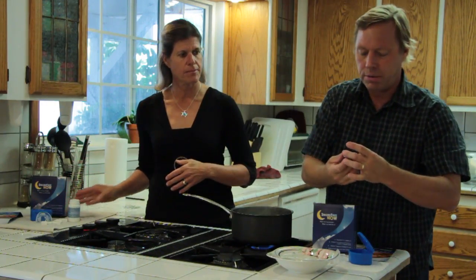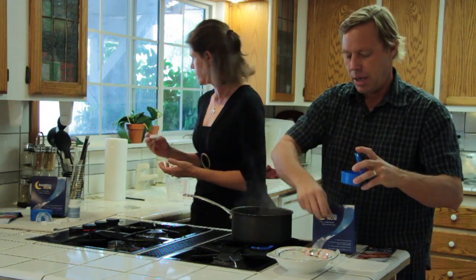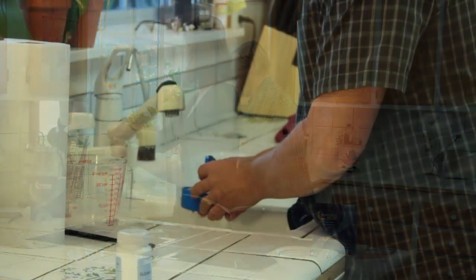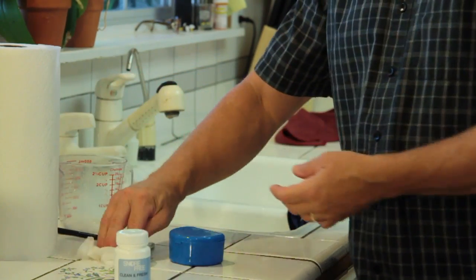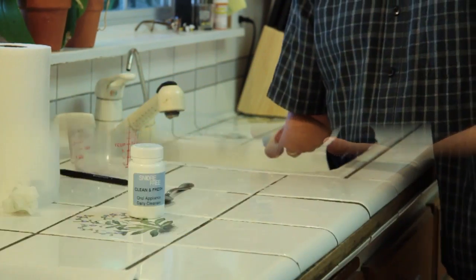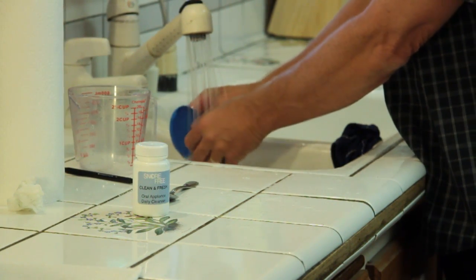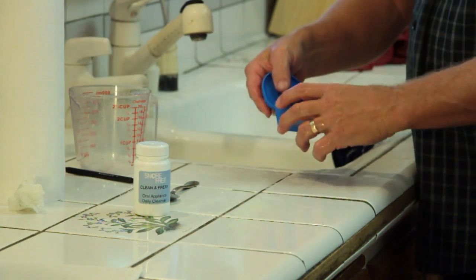Perfect. All right, so I'm going to put this in here. Alrighty. Put that back on. I sure will. Now I'll put some water in here and shake it up and let that thing soak for 15 minutes. Clean. And rinse it out real well. So rinse that case and rinse the mouth guard. And then I'll leave it open to dry.